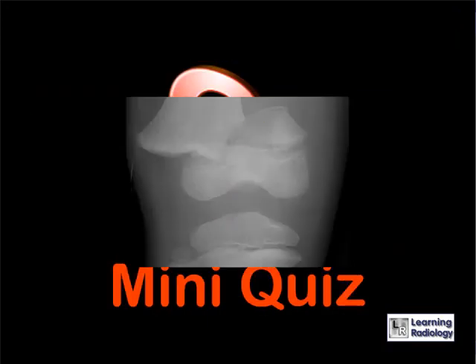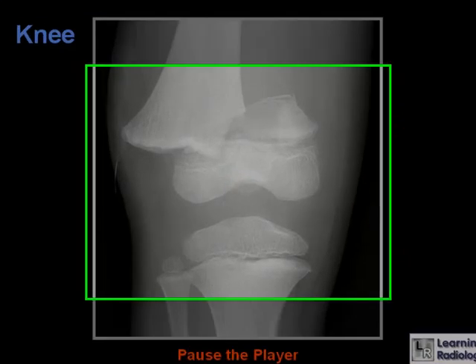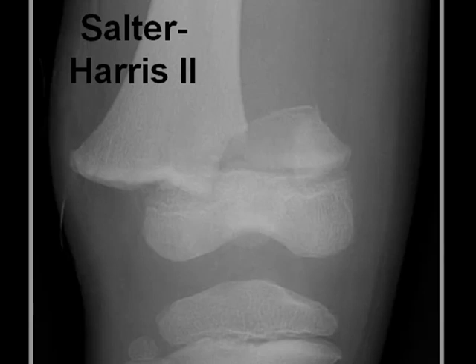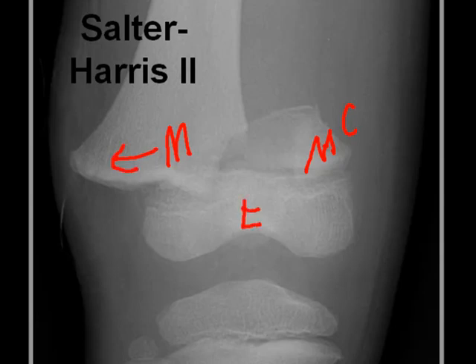Here's a mini quiz for you. Take a look at this knee injury and decide which type of Salter-Harris fracture it is. You can pause your mp3 player or computer. If you said it was a Salter-Harris 2, you were correct. This is one part of the metaphysis — this is the corner sign. Here's the remainder of the metaphysis that has been displaced laterally, and here is the epiphysis. The fracture extends along the epiphyseal plate and into the metaphysis — this is a Salter-Harris 2 fracture.